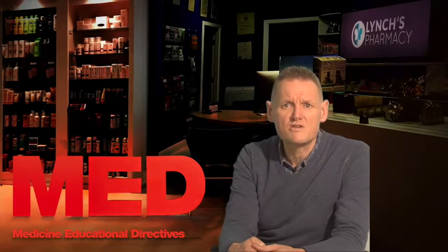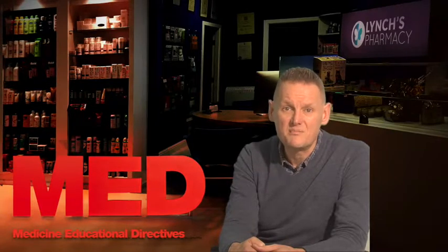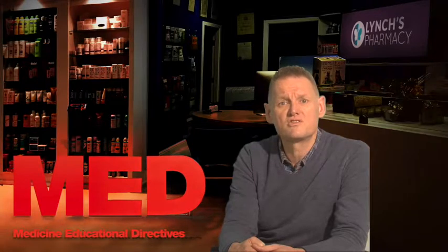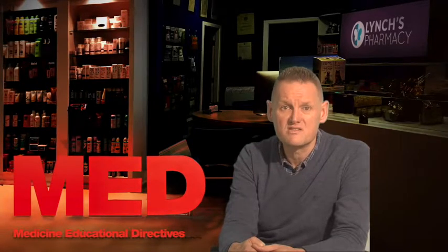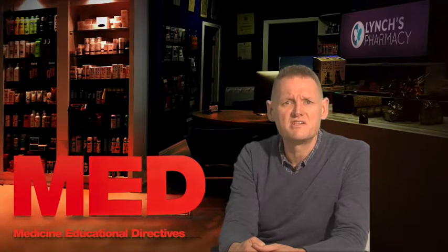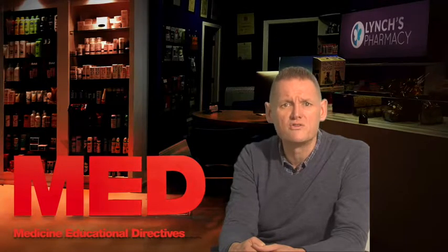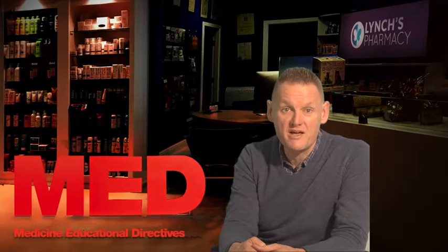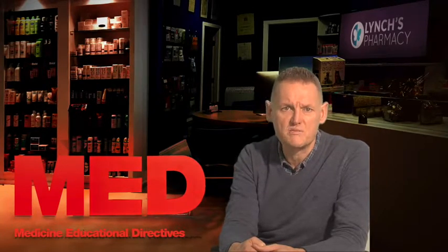The injection may start to work at different speeds depending on the site you use and various other factors such as if you've been doing exercise. In general, injections into the abdomen start to work quicker than those given in other areas. You shouldn't massage the injection area after administration of the injection.